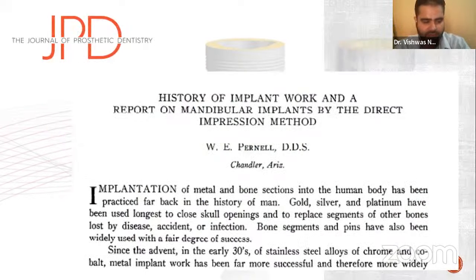This is the first article on implant impressions, published in 1952, whereby the technique described was removing the flap and then taking the impression of the naked bone. So definitely we have gone a long way from that to open and closed-way copings, and finally the digital pathway that we can see nowadays.